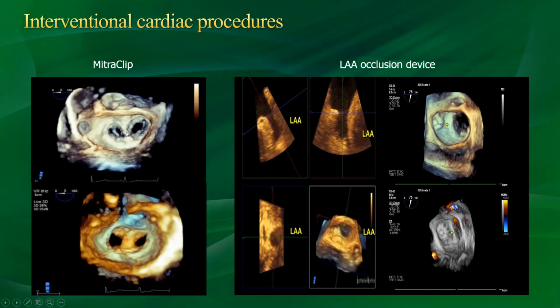and also post-operatively you can do accurate planimetry of the mitral valve area, because the concern with the mitral clip is that you don't want to end up with residual mitral stenosis.